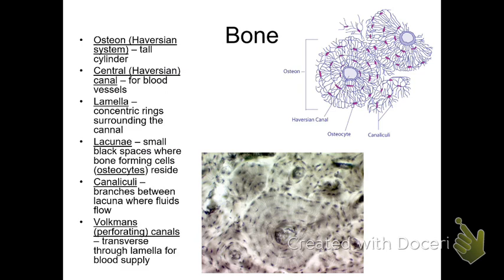Bone tissue is one of the tissues we'll be learning the most about this semester because there are some really cool things about it. And there are 6 different things that I want you to learn about bone tissue. So let's take a look at this.